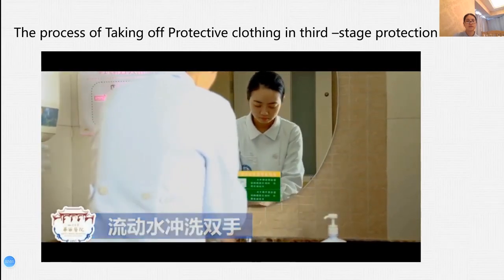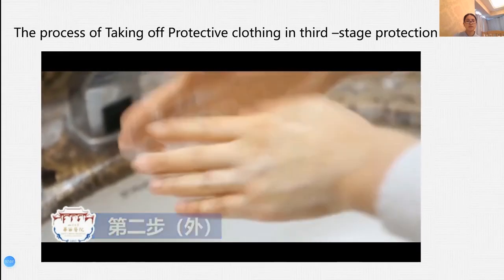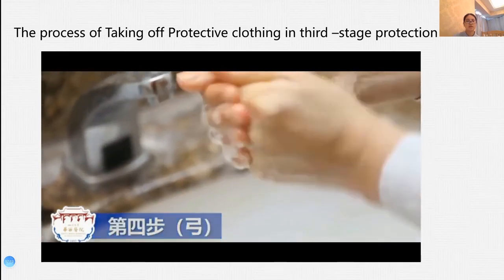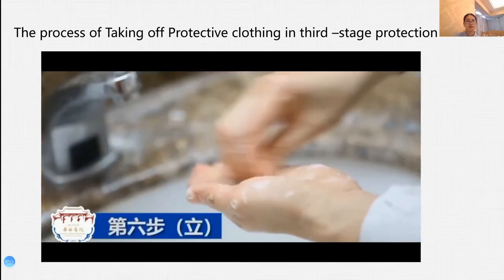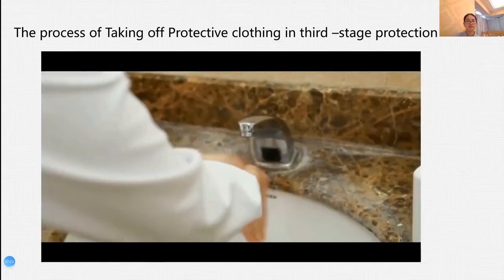And wash hands. First step. Second step. Step 3. Step 4. Step 5. Step 6. Step 7. And it's over. So this is the whole process of taking off clothing in the third stage protection. This is very important to avoid being infected.